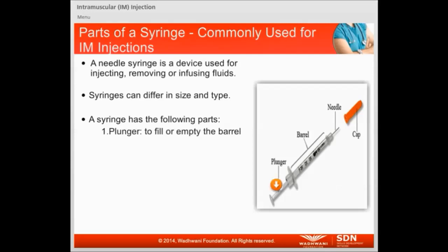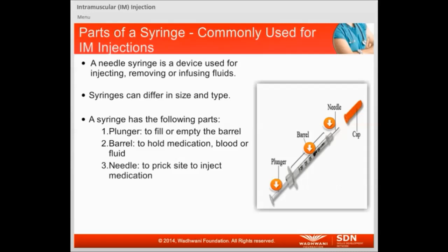Plunger, to fill or empty the barrel. Barrel, to hold the medication, blood, or fluid. Needle, to prick the site to inject the medication. Cap, to cover the sharp end of the needle.